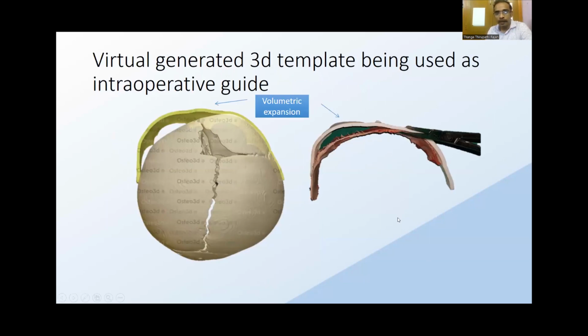Can you see how accurate the pre-op 3D printing and the intra-op model correlate? So this is the pre-op printing we did, and this is the intra-op. You can see what was in the template, with the correction template. This was the bandeau we removed. So we make small cuts and correct it so that it fits with the bandeau.